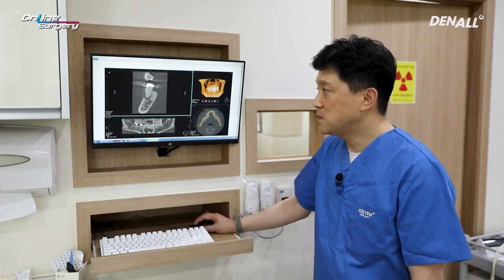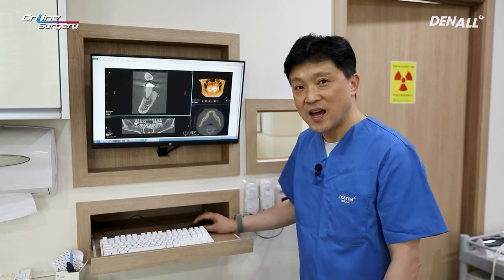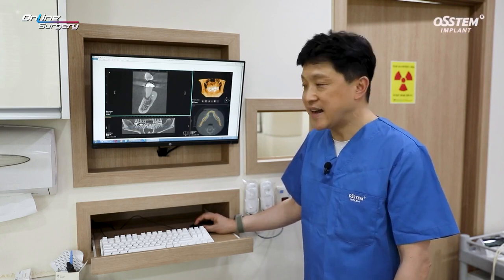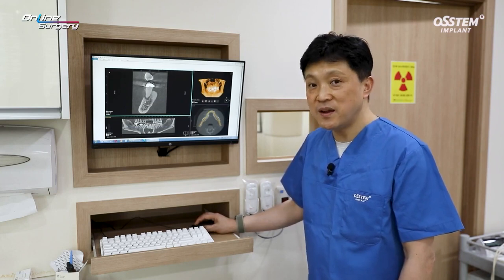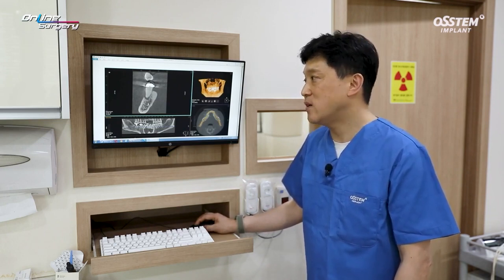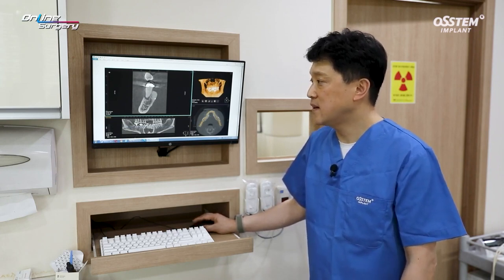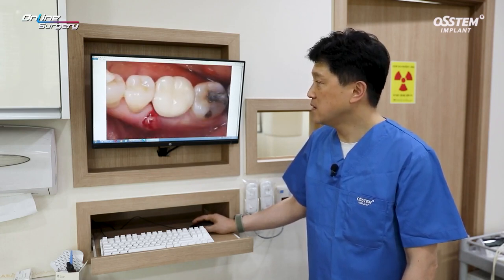When we look at this kind of CT, the precaution we need to take is that, as shown on the lingual side, the cortical bone is very hard. Because of that, when drilling is performed, it is very difficult to drill towards the lingual side, and there's high possibility that the drill will be deviated towards the buccal side because there's less resistance there. We need to think of this ahead. There's difference between knowing about it and not knowing about it. This can be a bit of a pickle.